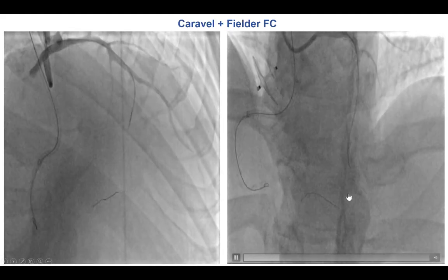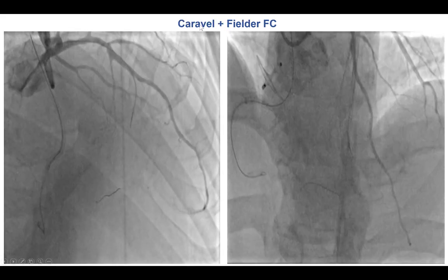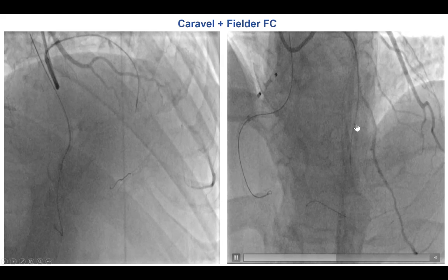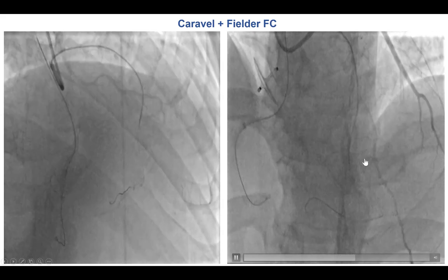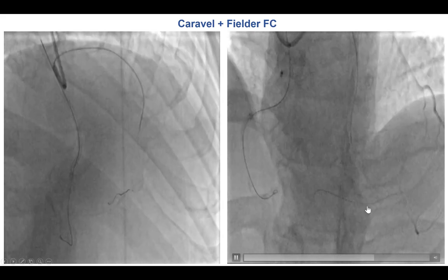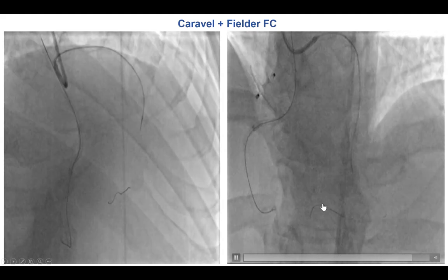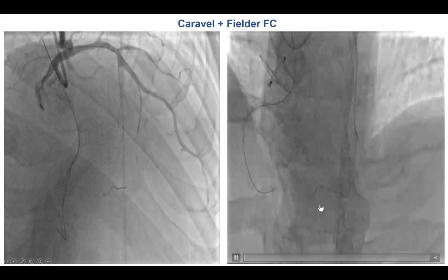Eventually, using the Caravelle and a Filder FC guide wire, we were able to cross into the right posterior descending artery.